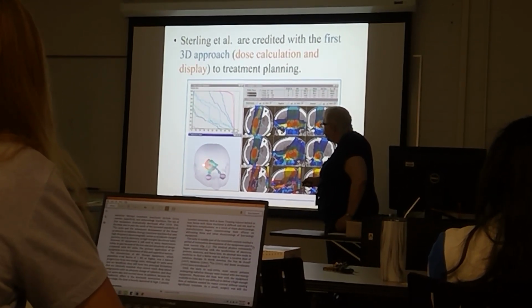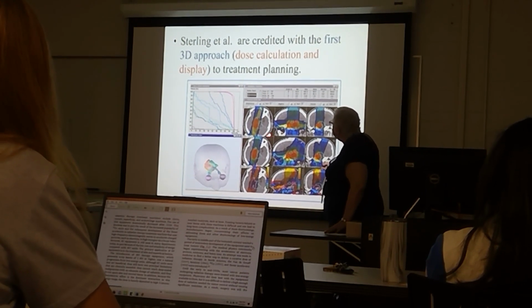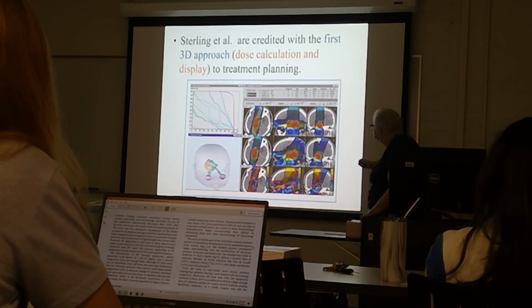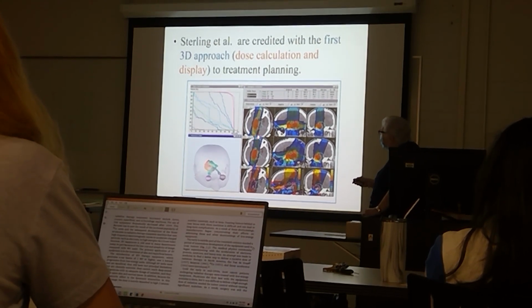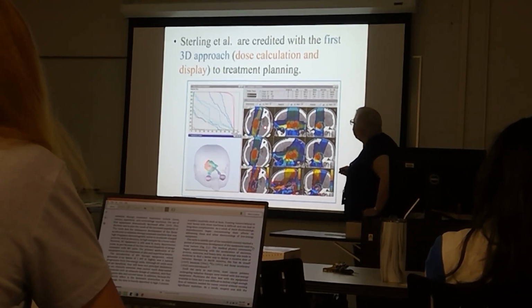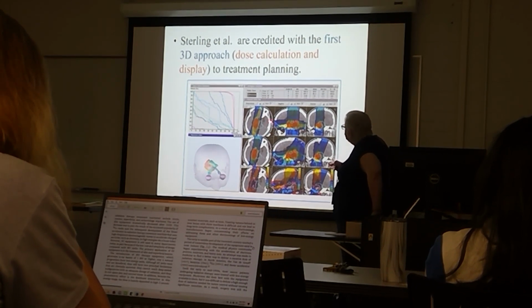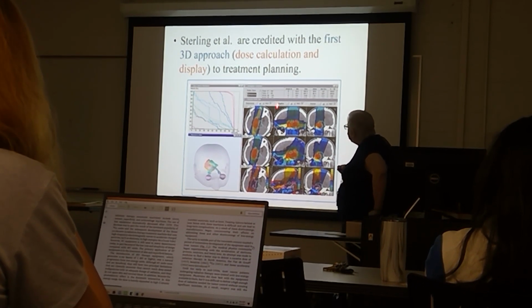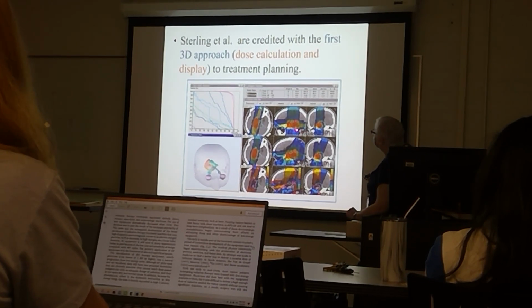So this is presumably the tumor. So we've got all these beautiful fields that we're trying to find. The red is the tumor. Here. So we've got 4 fields in this case. No, not 4 fields.